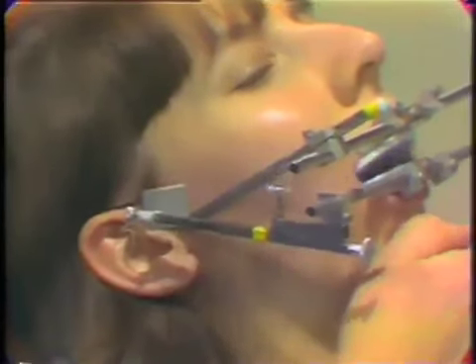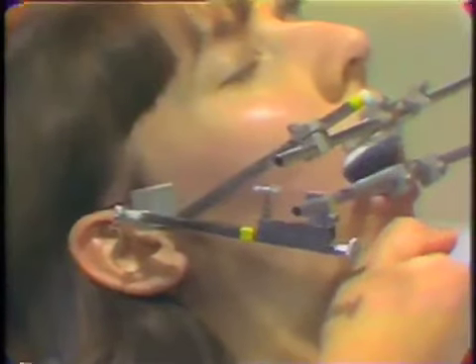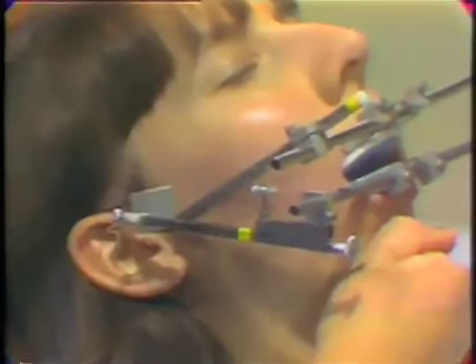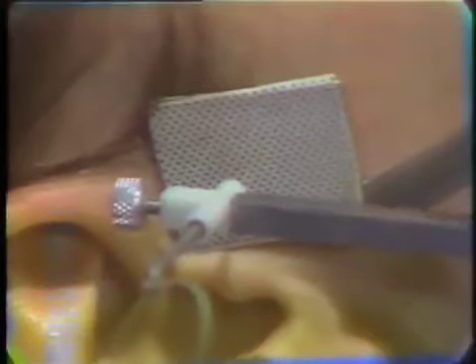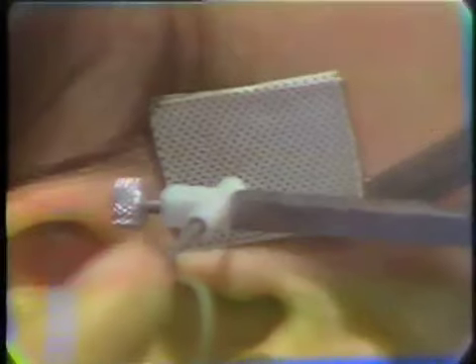So what we would do is have the patient open and close on this hinge position and observe the way the arcing is occurring. As you see here, the arcing is occurring superiorly and down. So we'd want to go towards the center of the circle until that point merely rotates.